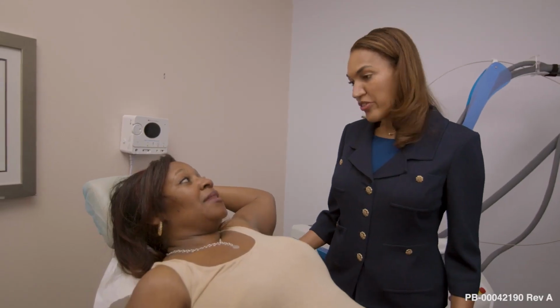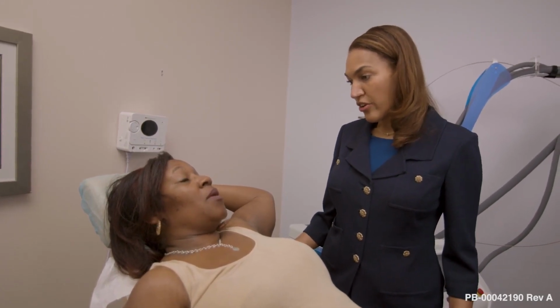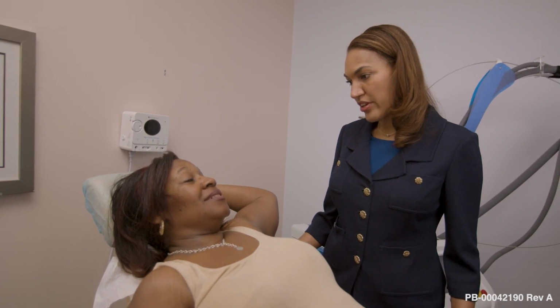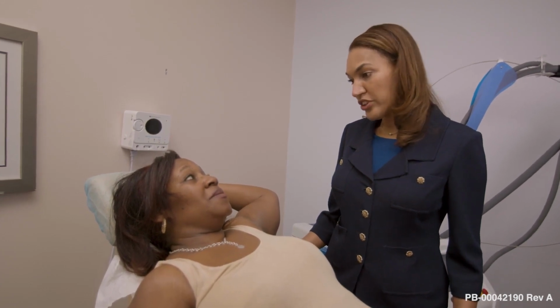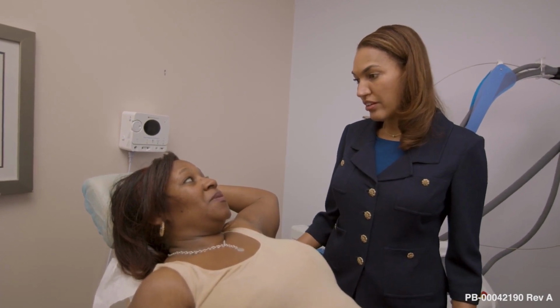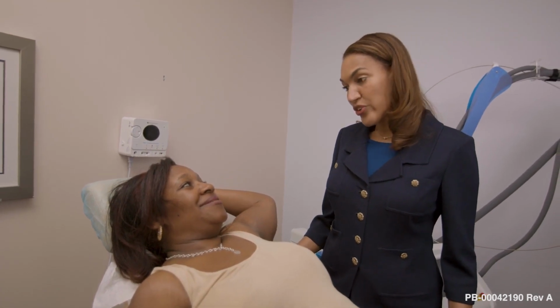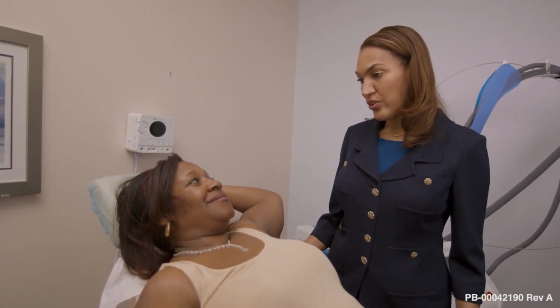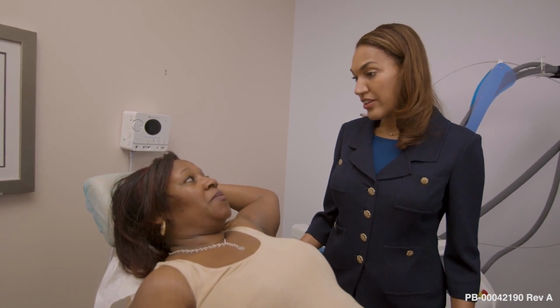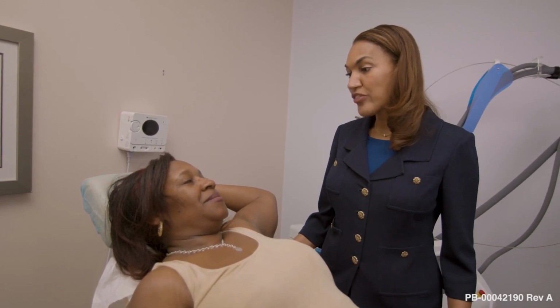Yeah, so looking under your arm, you have black coarse hair, and you do have some of that low-grade hyperpigmentation or darkness that happens from chronic shaving over the years. Okay. So this is an excellent machine to treat that because it tries to avoid that top skin color and go deeper to the color that's in the hair root. Okay, perfect. So because this is the first treatment for your underarms, we're going to use a lower energy, just as I did for your face. Yes, you did. And then as time goes on, we'll move the energy up to get those leftover hairs each time. Okay, sounds good. Any questions today? No questions. Okay, good. We will treat.